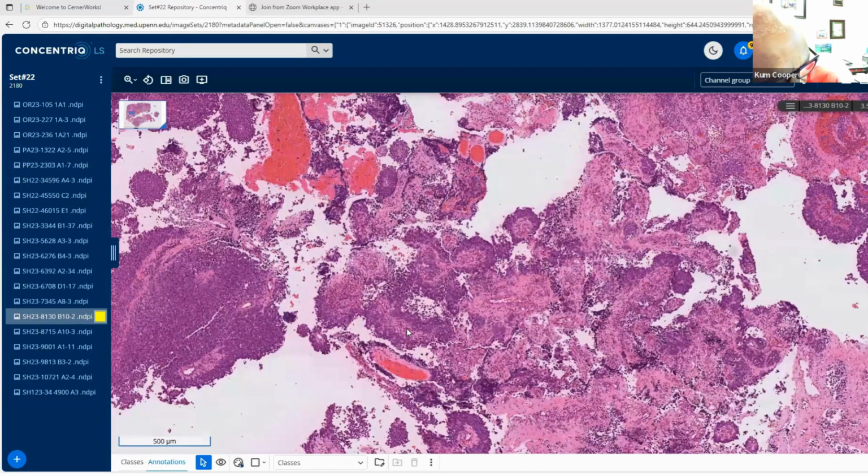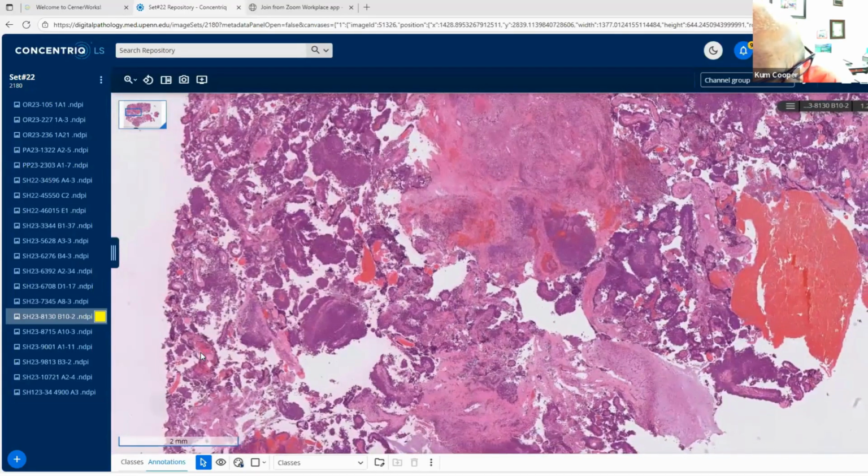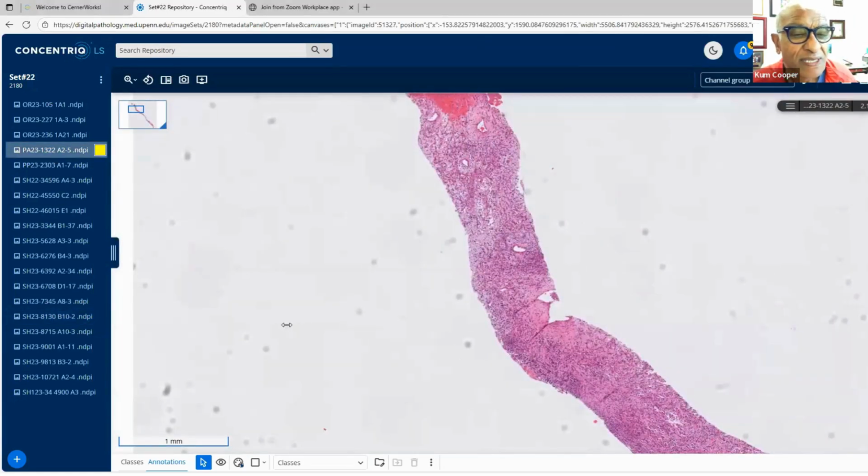In thinking about these small round blue cell tumors, the only way I can recall all of them is to go through that and try to work it out. We do have a panel in our immunos that addresses all of these. Any questions or comments on that? If not, I can take you to my next case on this list.